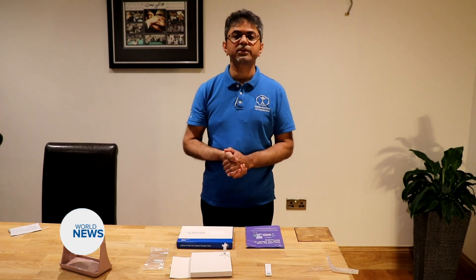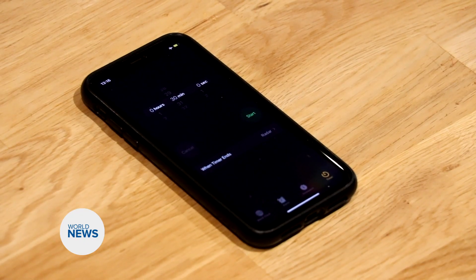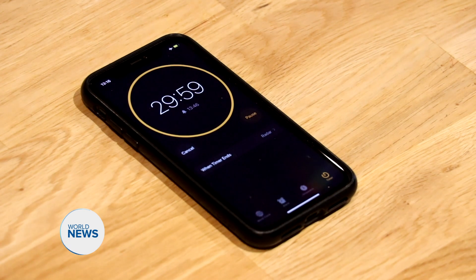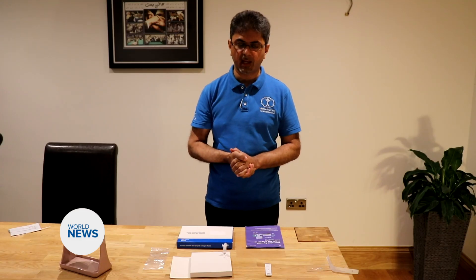Now we need to wait for 30 minutes and we're going to set ourselves a timer, after which we're going to read the test. It's important that the test is not read until 30 minutes have elapsed, as a false reading can be had.